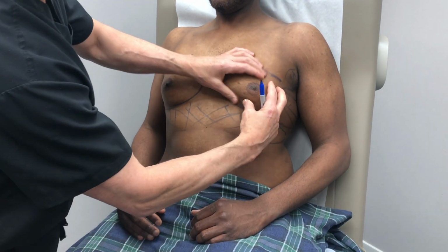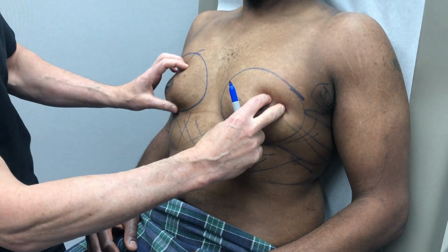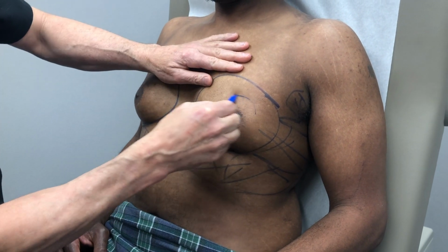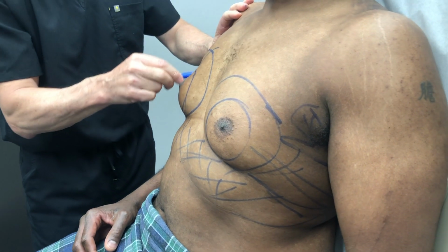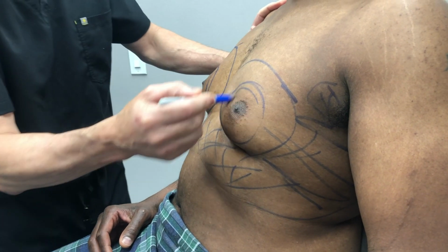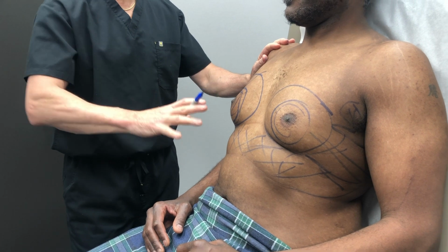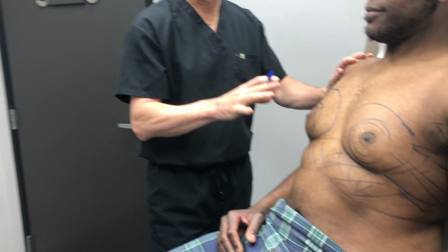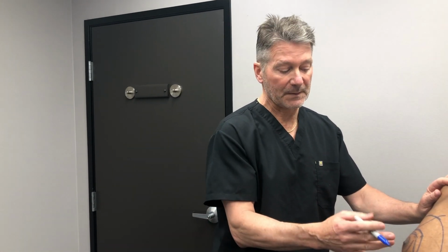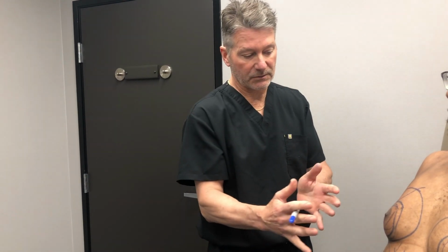All right, so the deal is, which is interesting, you're going to think, oh, well, he's this size, so he's going to have a lot of tissue. But I don't think he really does. I mean, he's got gyno for sure, but it's not going to be like the home run. We love the glandular tissue. He's going to be mostly fibrofatty in nature. So what I'm trying to tell you is that these mountains, or any gyno, or any breast-like feature here could be made out of a lot of stuff, and it doesn't necessarily have to be the gland. You don't have to feel the gland. You don't even have to have the gland. Most people do, and it's underneath the nipple areola complex, but you know that this is gyno tissue because that's what's making this whole thing projected.